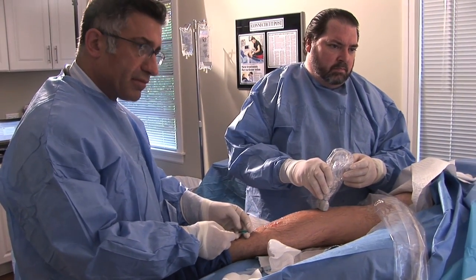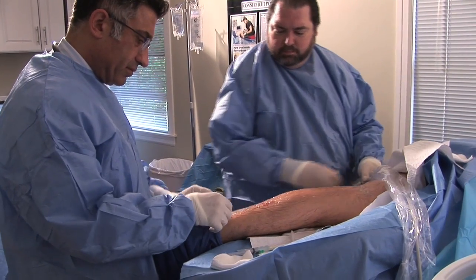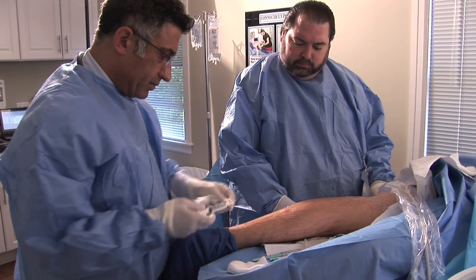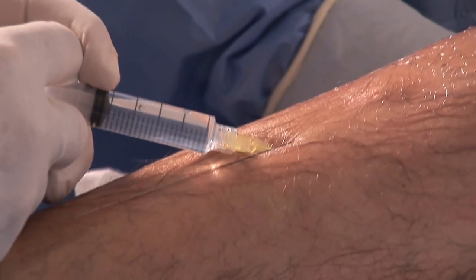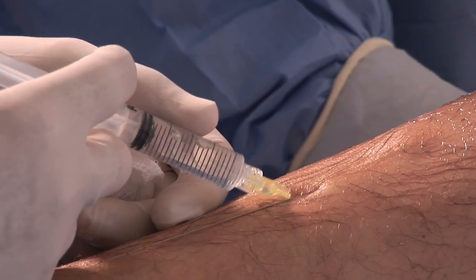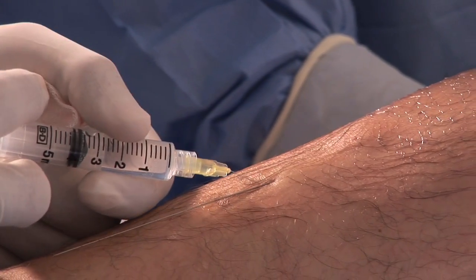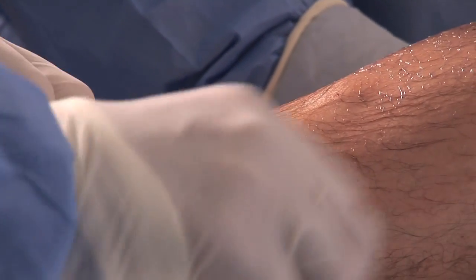Then through a series of maneuvers including a very tiny incision, we insert our radiofrequency catheter inside the vein, which closes the vein shut — that is faulty — by thermal ablation or by thermal energy.